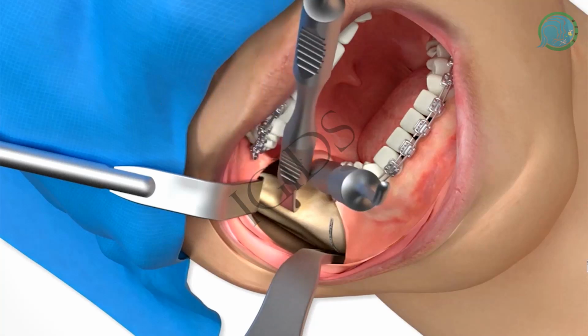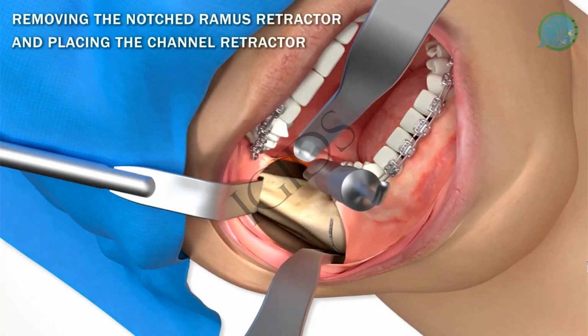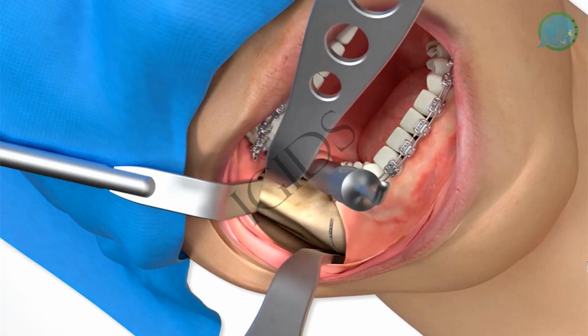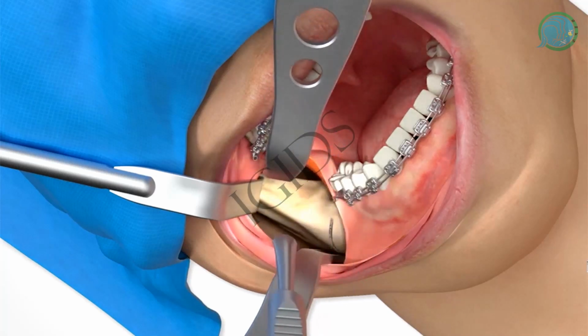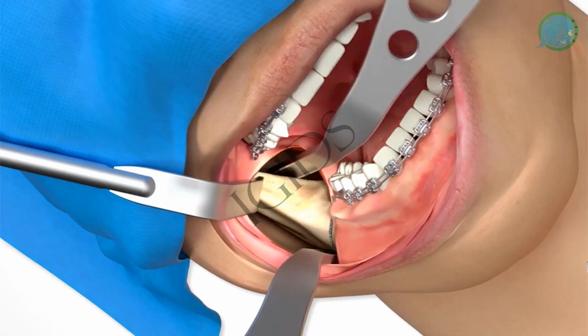Is identified. The cut starts above the lingula, parallel to the occlusal plane, and is continued inferiorly through the lateral cortical bone at a 90-degree angle and ends between the first and the second molars.